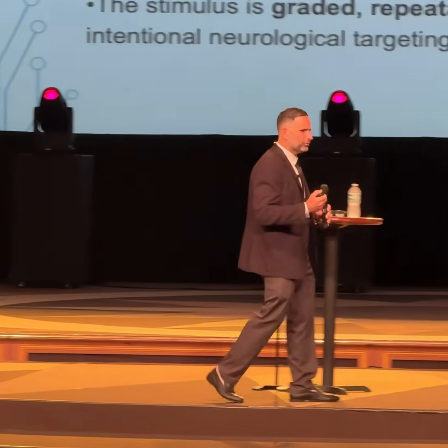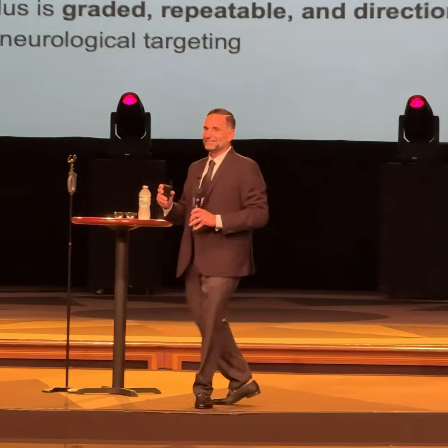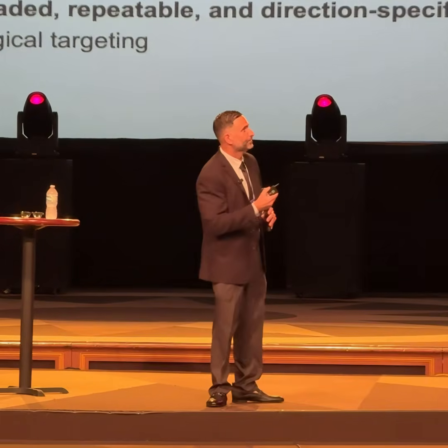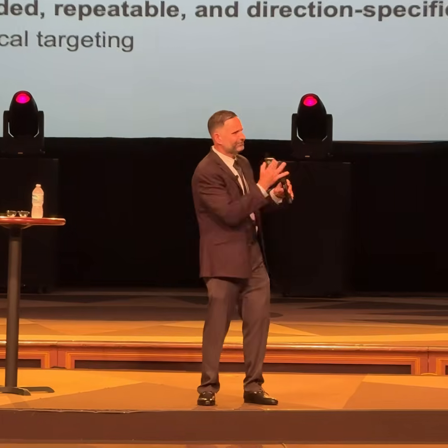Motion. So if I were to spin somebody, what part of my brain do you think I'm activating? Yeah, so when I'm turning, think about that I'm doing a directed stimulation of that vestibular system, okay? So when we talk about a multi-axis rotational chair, it's a fancy tool.